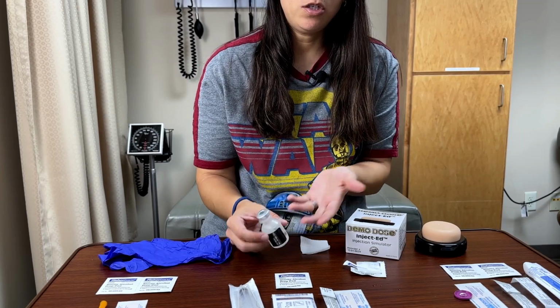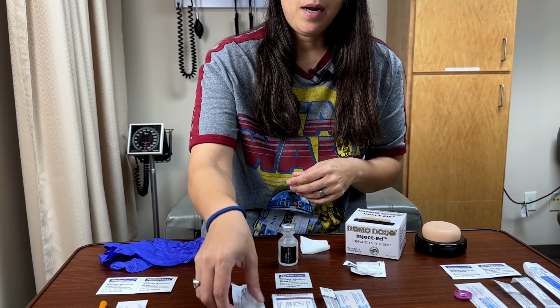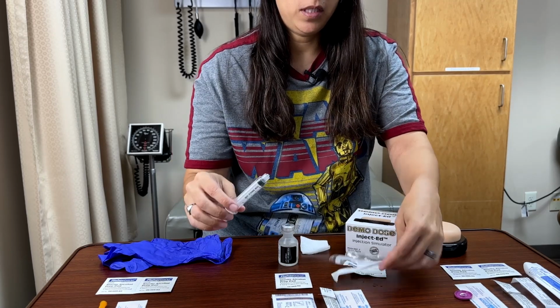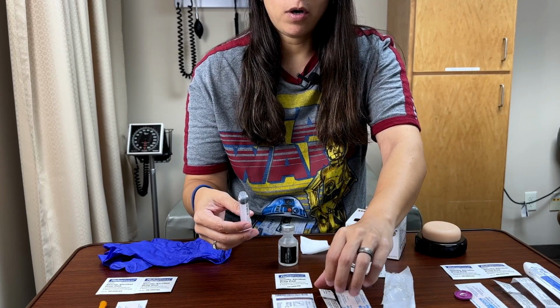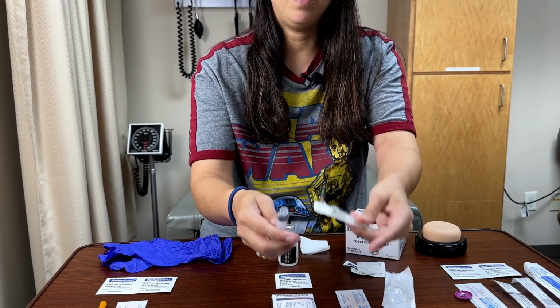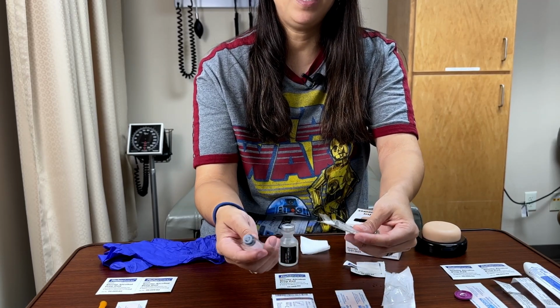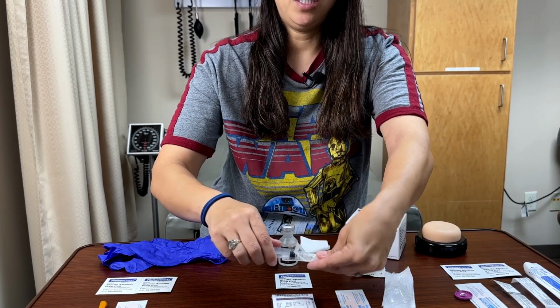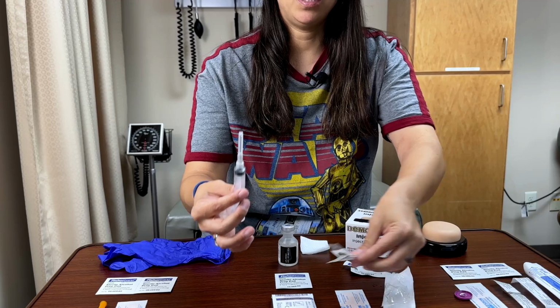We already checked the medication, made sure everything was good with it. Now we're going to take our syringe. This is a 5 cc syringe, and I'm going to take my drawing needle. Whenever we put on a needle, we don't want to be touching everything on the hub here, because all of that is sterile. So we want to just open it up and attach it while it's still in the packaging, so it's nice and clean.